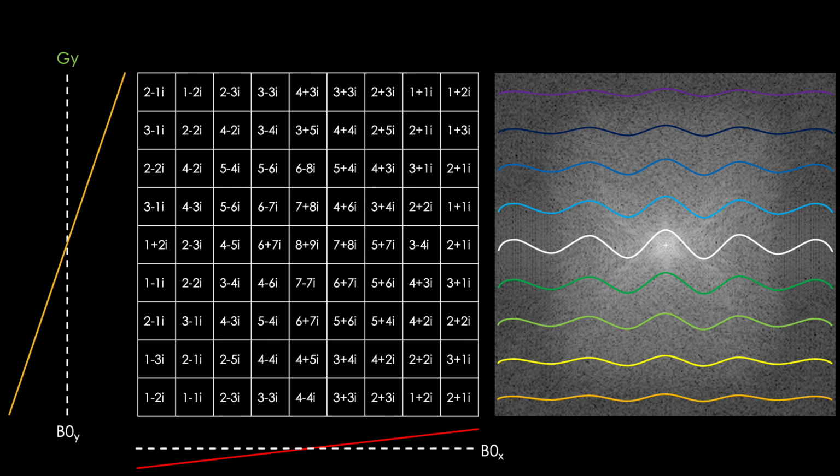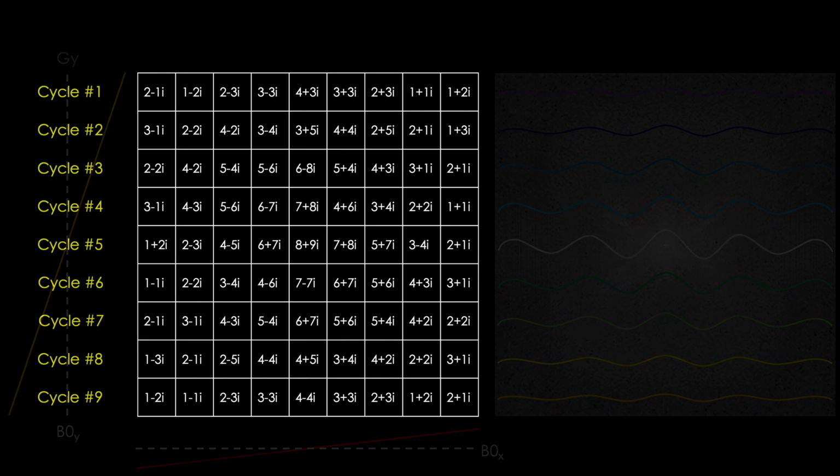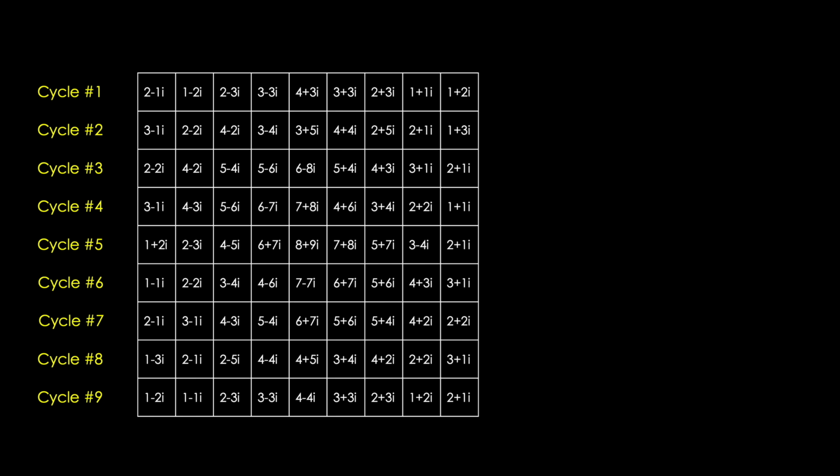This is a very selective example that leads us into the next topic, which is another source of confusion: the order in which we fill K-space. We will always fill in this data matrix from top to bottom, starting with the first cycle, followed by the second, and so forth for however many cycles we want, with the time of each cycle of data collection moving from left to right. Remember, the order of the cycles has no bearing on our image formation.